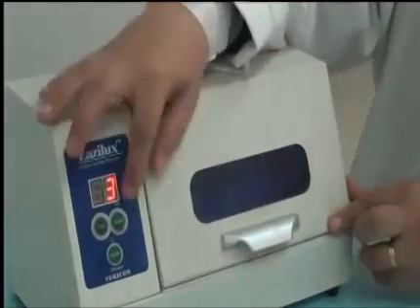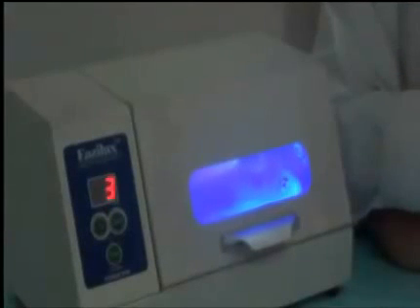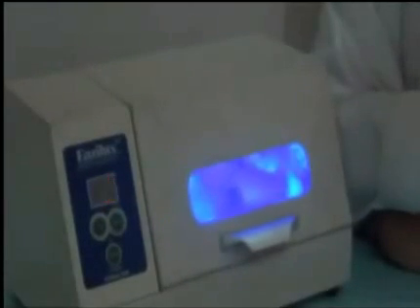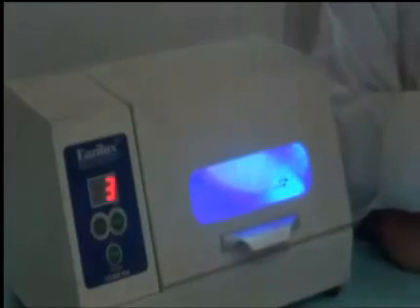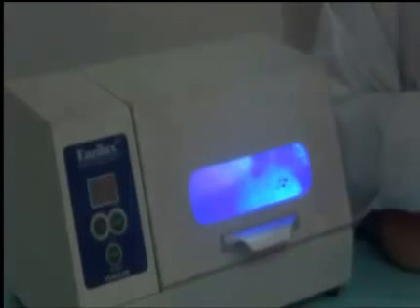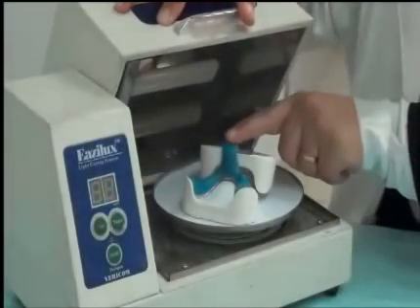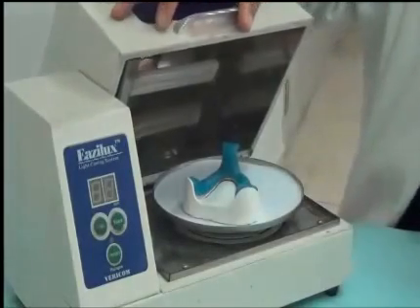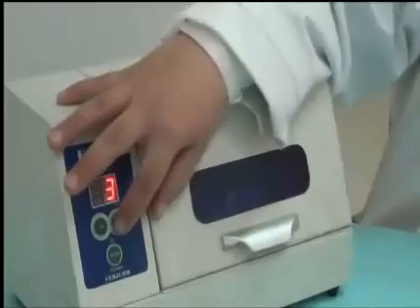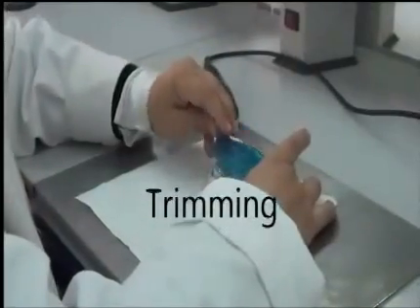The idea is we need to remove the support while it's curing, because the support material will be preventing the light from entering into that area where it's touching. So we need the handle solid enough to take the support away and complete the curing cycle. Once more. Now it's hard enough. I could remove my support material and then cure it fully till it's finished. Now we're going to trim the borders.